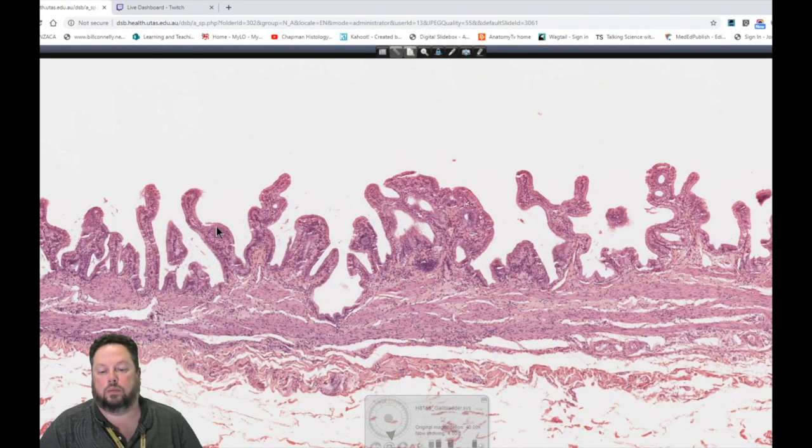All right. Any questions about the gallbladder here? So, do the tunnels in the epithelium have a name? They do have a name. It's a name in pathology. Anyone able to help me out? I shouldn't, but I can Google it. I haven't referred to them, but they do have a name.